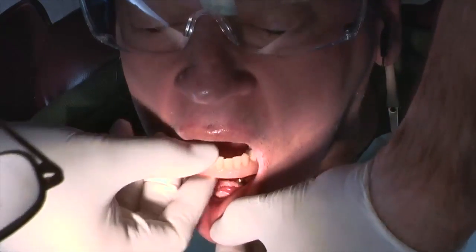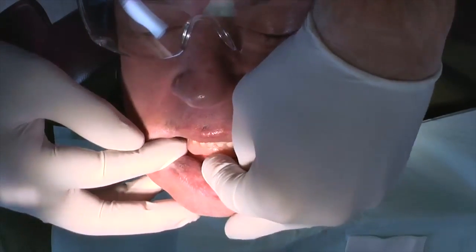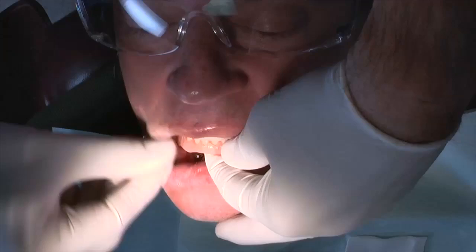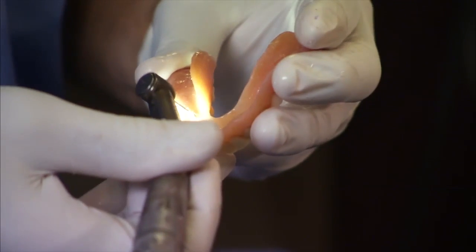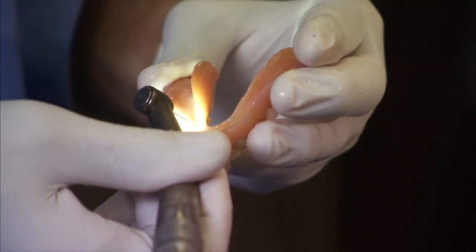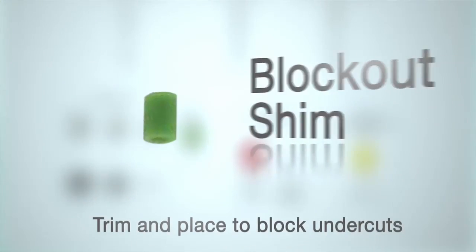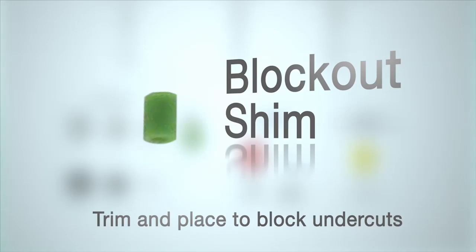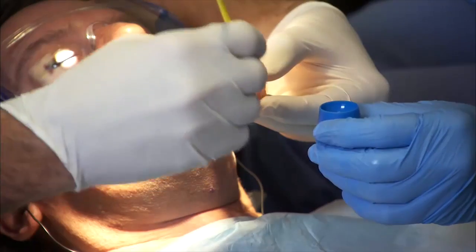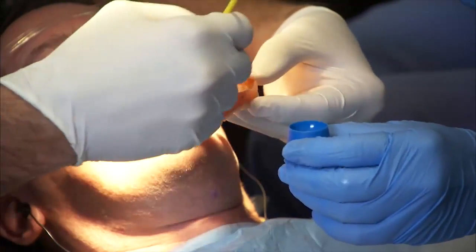Place the denture over the 4 housings to check for a good passive fit. You may relieve the denture border a few millimeters for added comfort. Adjust the openings for the housings in the denture if required. Trim and place one block-out shim on each implant abutment to block out any undercuts. Then remove, clean, and dry the denture tissue contact trough surface and apply a thin layer of adhesive to that surface.